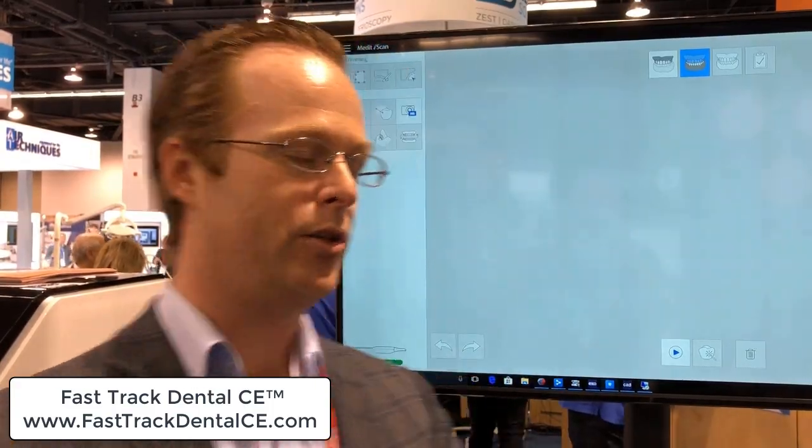I got a lot of flack online about scanning a model. People are saying it just doesn't work, it's only okay, this scanner does this or that. But I gotta tell you, this thing is outstanding. So I came to CDA today to give it a test on a live patient. Let's do that right here.